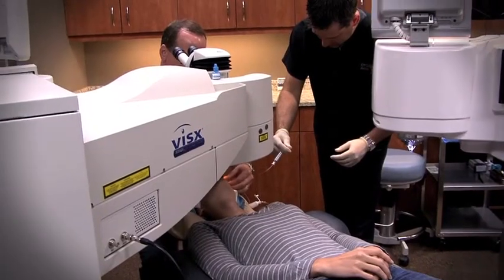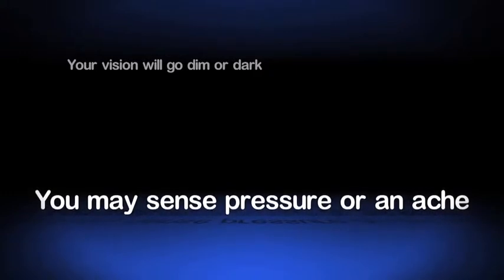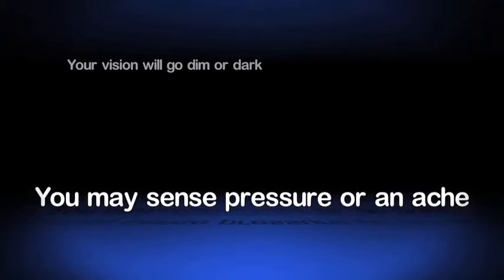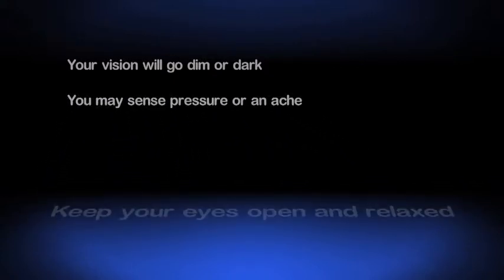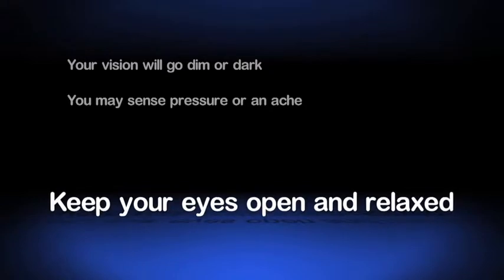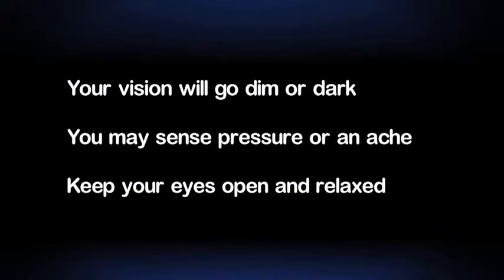When the suction is turned on, there are two things that you will notice. First, your vision will go dim or even dark during this part of the procedure. While scary if you don't know what's coming, that is perfectly normal and will not be a surprise. We will coach you through each step. The second thing you may notice is a dull ache or a pressure sensation during this portion of the procedure. Again, this is perfectly normal and will only last for a few seconds. If you feel pressure, your normal instinct is to squeeze or close your eyes, but we will be instructing you to simply keep both eyes relaxed and open.